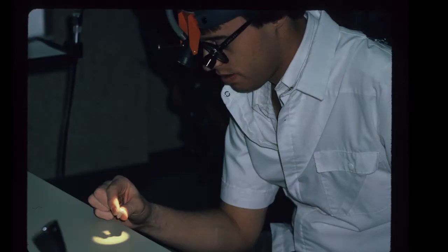Lighting is the other key factor, and it must originate from between the binoculars. Here, Mike is looking through the distal canal of a lower molar, and the spot of light on the table demonstrates that the light does in fact go straight down through the visual pattern. In other words, the canal is fully illuminated from one end to the other.